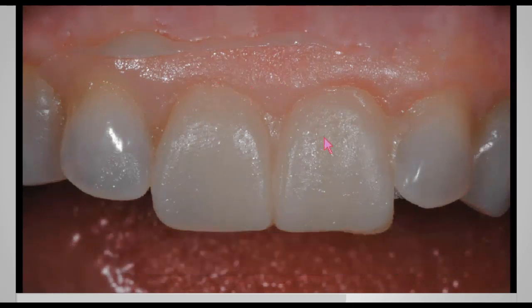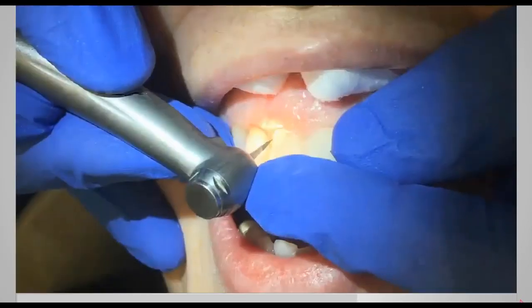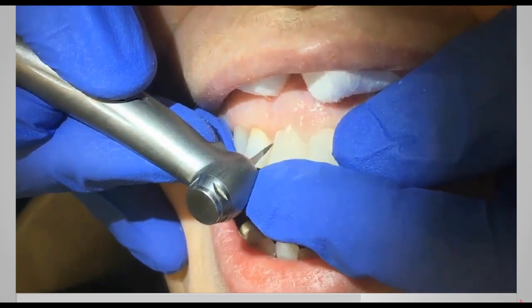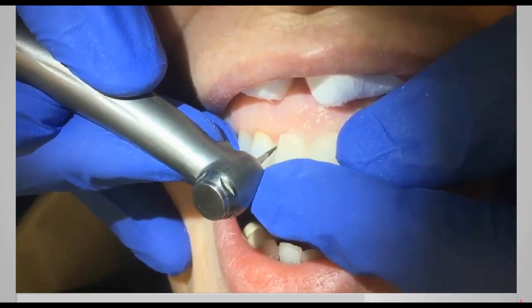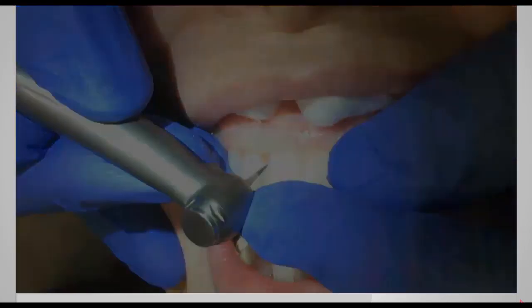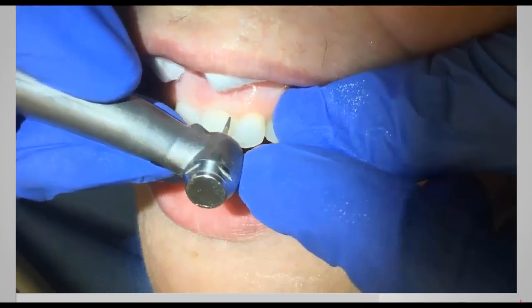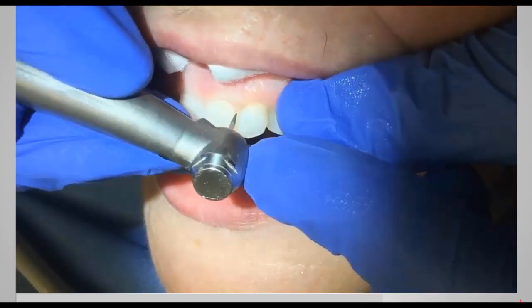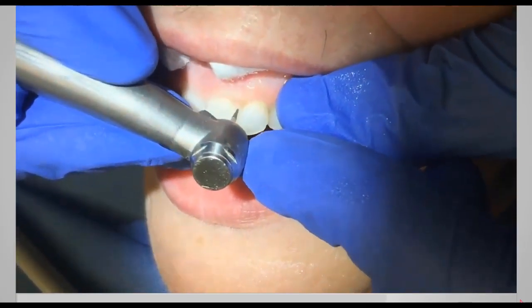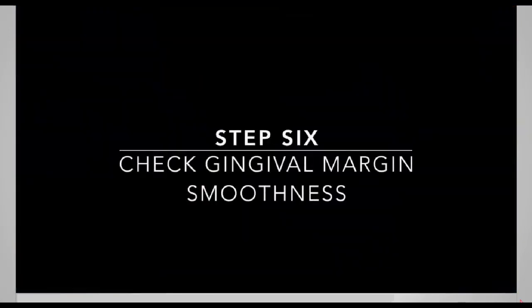Very easy to remove. And you'll see on the video, again, I want you to keep in mind, this is the first time ever Mr. Shepard, third-year dental student, was doing this. So he's being very careful, and see the very thin diamond, kind of needle type of diamond burr, and he's getting into the embrasure area. Patient is not numb, so he wants to be careful that he's not going to damage the tissue, or do anything that may make the patient uncomfortable.